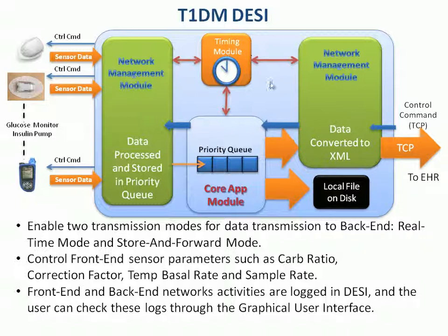The timing module here has transmission modes such as real-time mode or store and forward mode. Real-time mode means DESI gets a message and sends it right away, and store and forward mode is for situations like when the patient goes out using a cellular phone. Sometimes the backend connection is not available, or sometimes you have limited bandwidth. This mode is mainly for that.